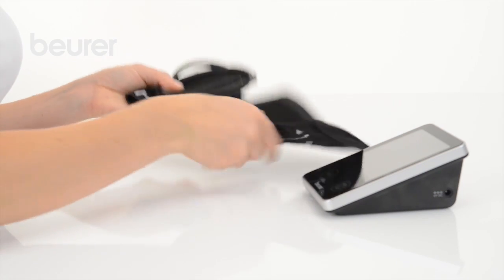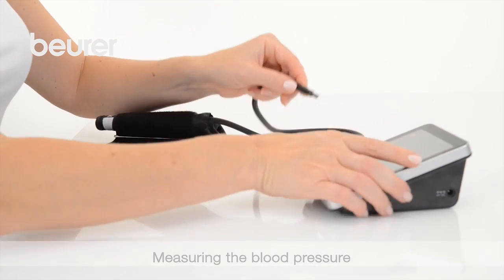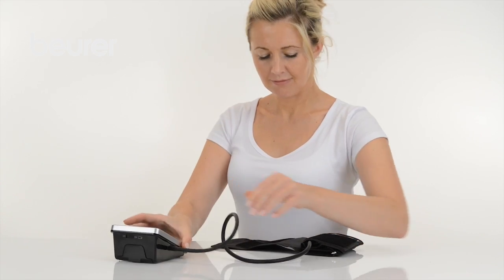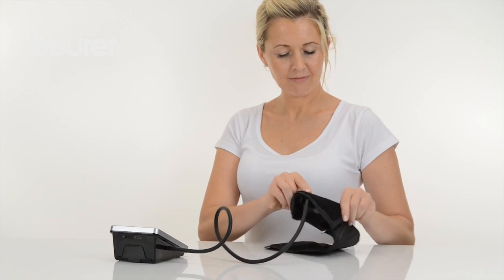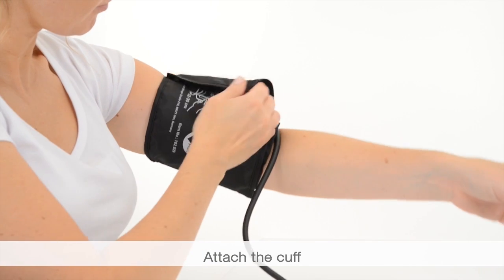Let's move on to measuring the blood pressure. The measurement can be performed when sitting or when lying down. Adopt a comfortable posture. Position the cuff on your bare left upper arm two to three centimeters above the elbow.